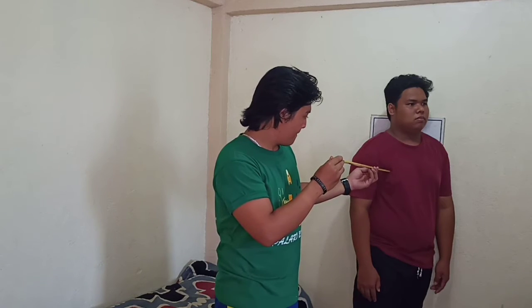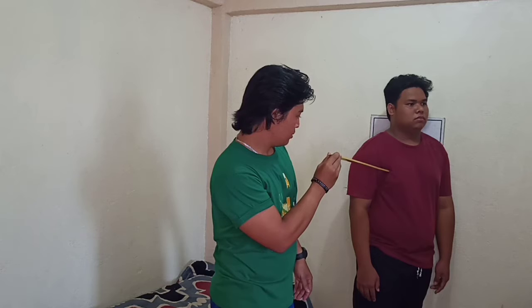The central ray must be perpendicularly directed at the level of the T7. The structure shown in this projection is the zygapophyseal joint farthest from the image receptor.